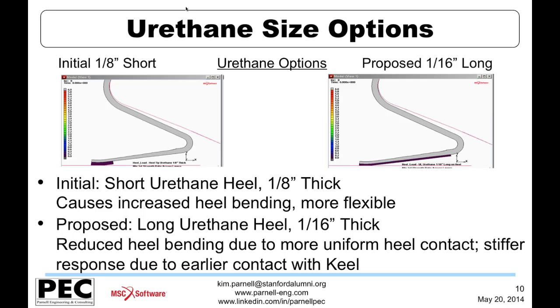So as I said, this is focusing on the heel component and comparing two different alternatives. Looking at this urethane pad component on the lower portion of the heel, so a thicker and shorter length of urethane as compared to a thinner and longer set of urethane, and looking at some of the aspects of each and what they represent in terms of loading onto the carbon fiber composite heel and the effects of them then.